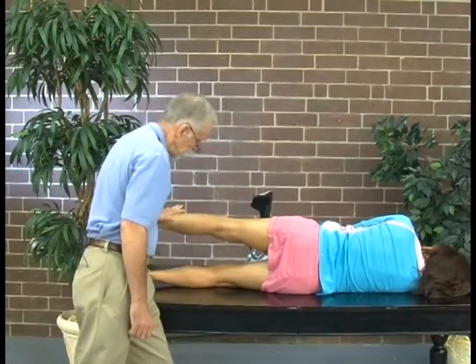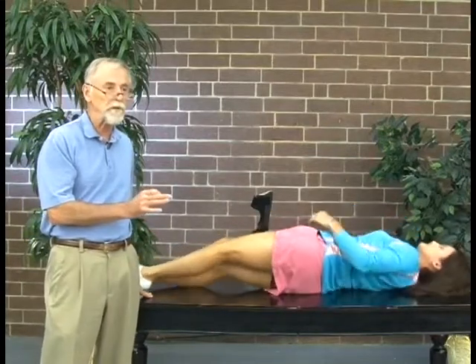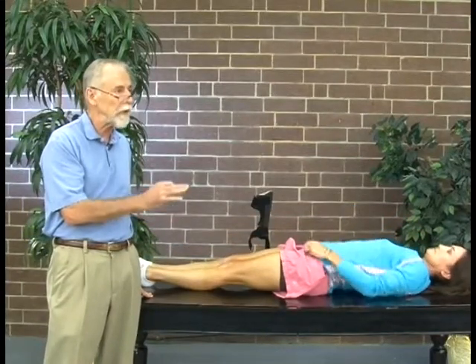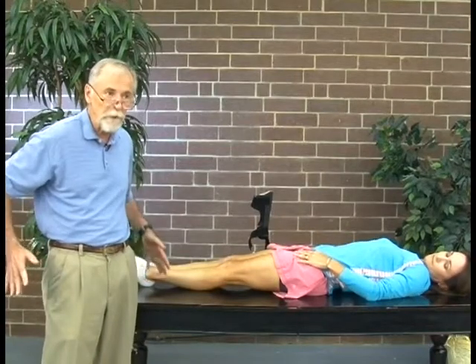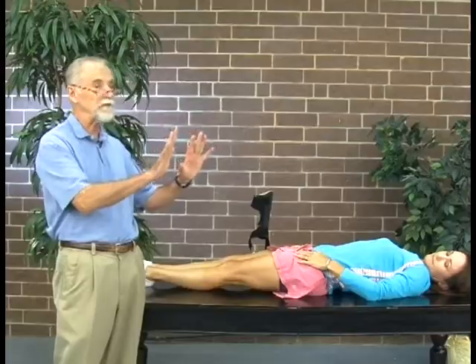She's developed excellent hip strength, which was very weak when she first started. Using the brace has allowed her to get back to where she has normal strength in her pelvis, which controls her running form so she doesn't have abnormal shifts in her upper body.